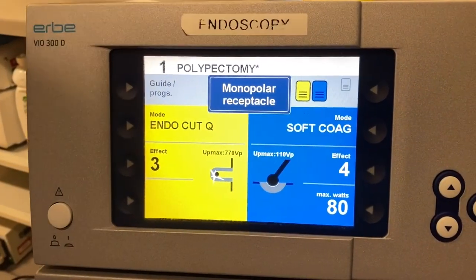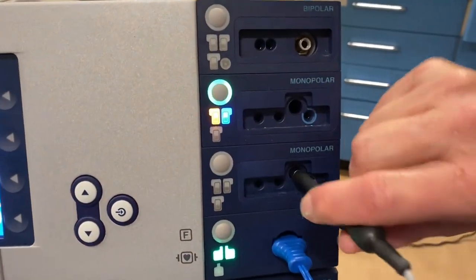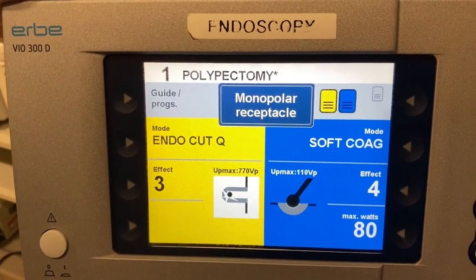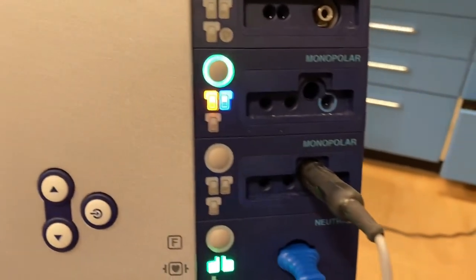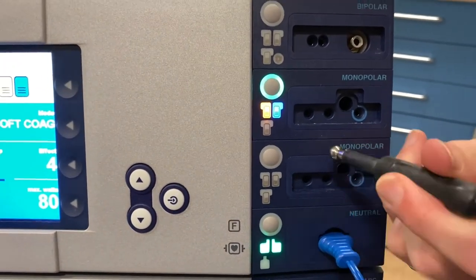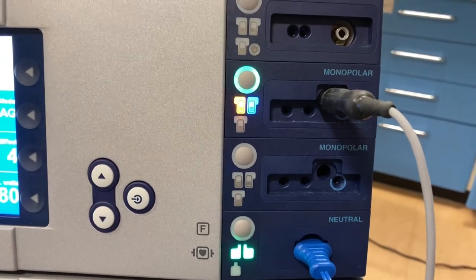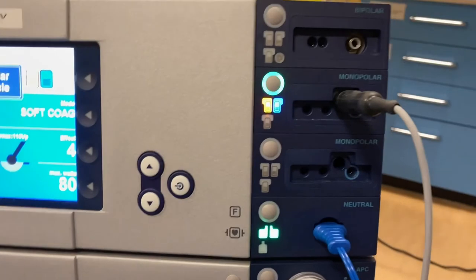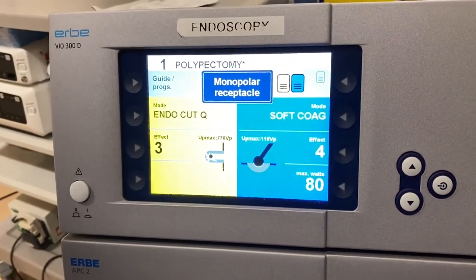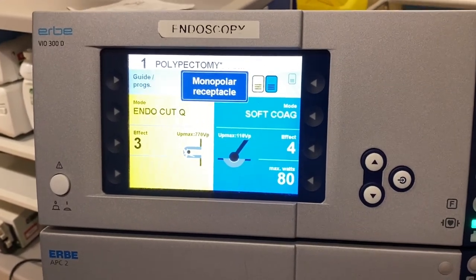The second thing, and a more dangerous problem, is when you set up and everything looks good, and you start your polypectomy and you hear that noise that suggests current is being applied — but actually you're getting no current. Everything looks good on the machine, but it's because you're actually plugged into the wrong channel on the electrosurgical generator. Rather than giving you a fault signal, it gave you the noise that made you think you were applying current. The danger with that is that you may cut through a polyp cold, without any application of electrosurgical current, and end up with a brisk bleed from the stalk of a polyp. So those are just two examples of how things might go wrong, and it's imperative that you understand those things ahead of time.